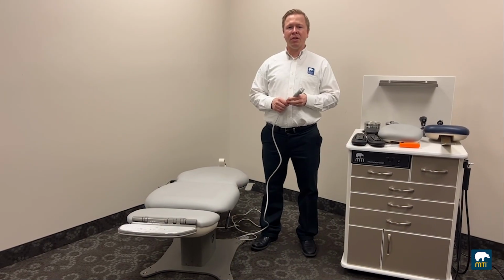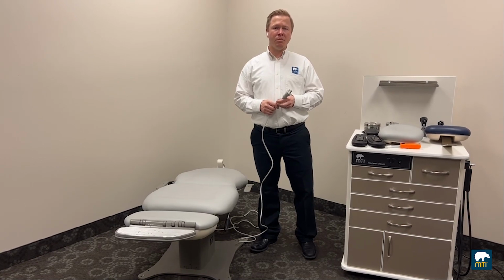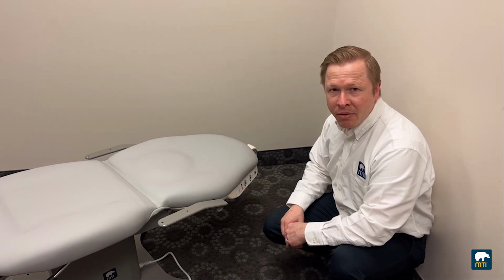The power cord is already attached to the chair. Plug in the wall and wait a few moments until it's fully powered up to move the chair. Now that the chair is powered up, the next step is to bring the backrest up. The 461 and 403 are both equipped with easy view switches. Simply push the home button and let the backrest come up.